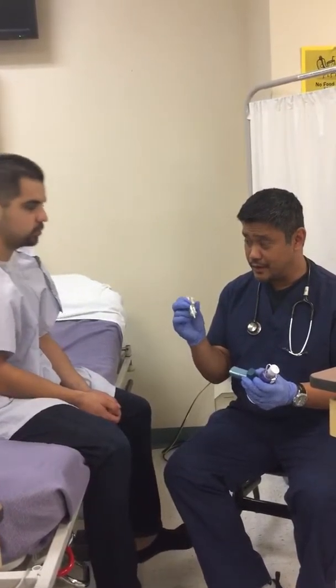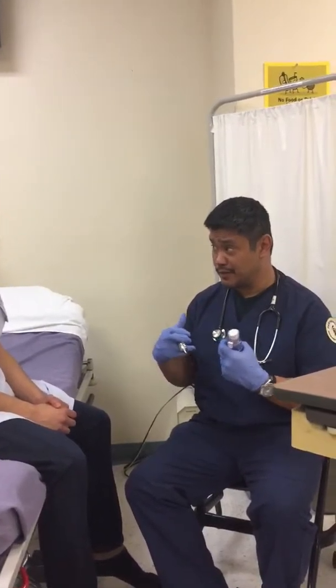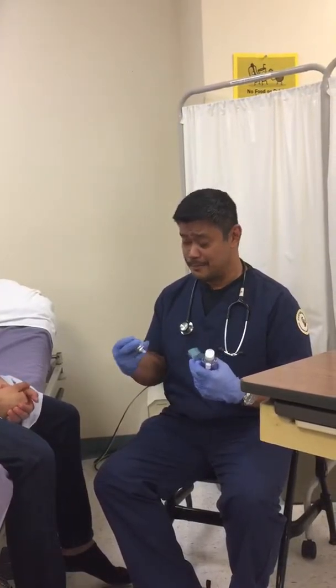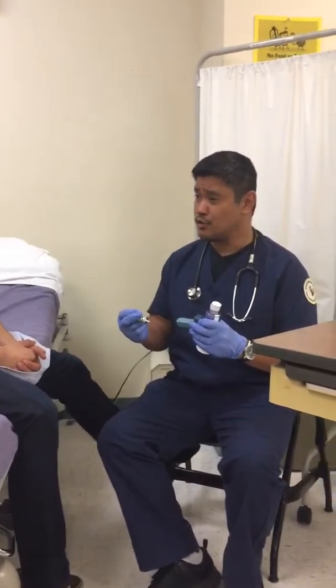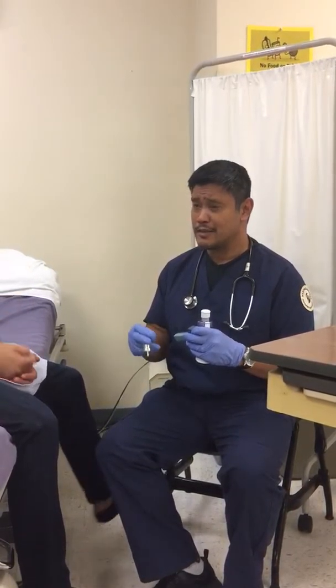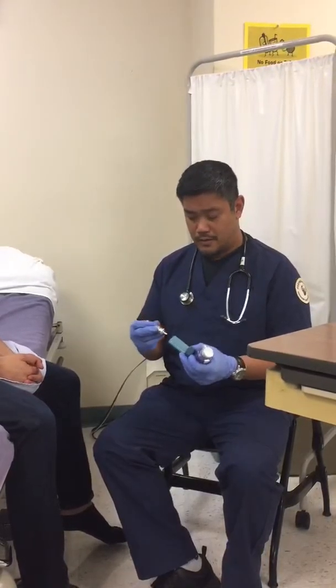It's within this canister, and the albuterol will help open up your lungs. You have a bit of restrictions right now, so it'll help you breathe a lot better. There are side effects. It might make your heart rate a little bit higher than normal, and it might make you a little jittery. But not everybody gets them, and if you do get them, it's perfectly normal.